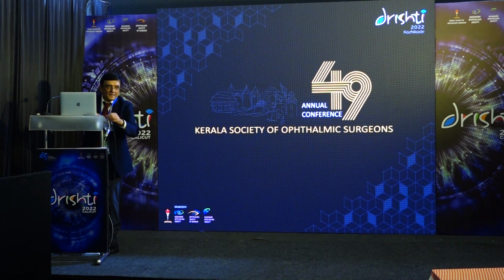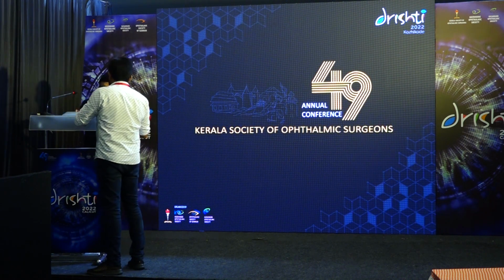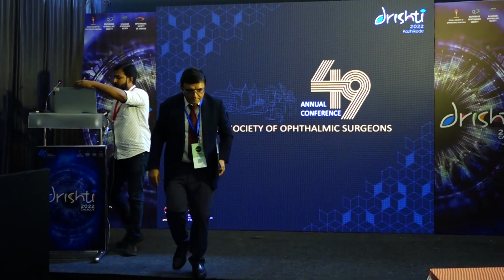Just one or two parting tips on FFA. One is always have a crash cart ready. Those who are doing FFA, please have a crash cart ready. Second, don't leave the patient without a 1 hour observation, at least, following the procedure and documenting the vitals after your FFA. Third, even if the patient has no comorbidities, there is no harm in checking creatinine. Check creatinine on your own, and if it is high, please have a renal clearance from the nephrologist and not from the physician, from the nephrologist itself, and document it.